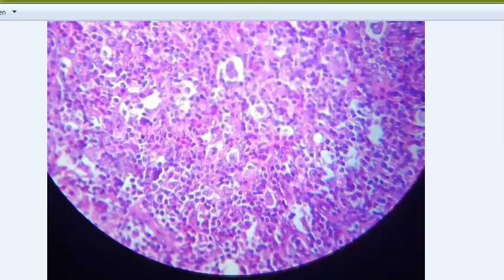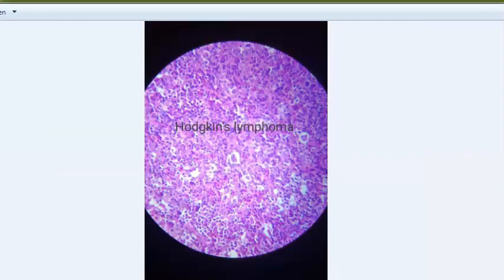You should be able to see Reed-Sternberg cells in this slide. This is Hodgkin's lymphoma. It is a neoplasm of the lymphoid tissue - the normal architecture of the lymph node is distorted. You will see tumor giant cells like Reed-Sternberg cells, which can be mononucleate or binucleate with owl's eye appearance. They have prominent eosinophilic nucleoli.